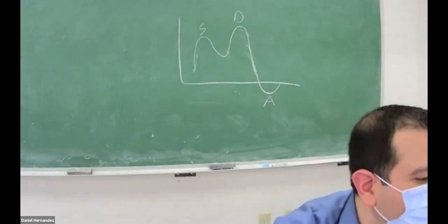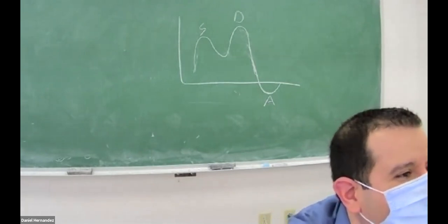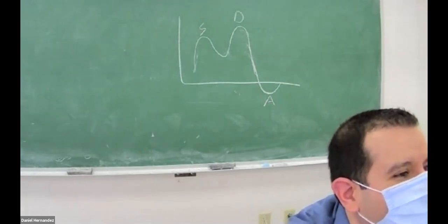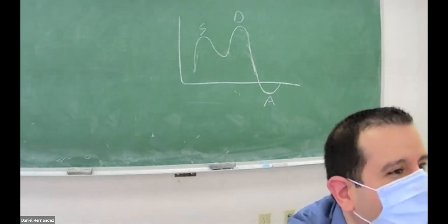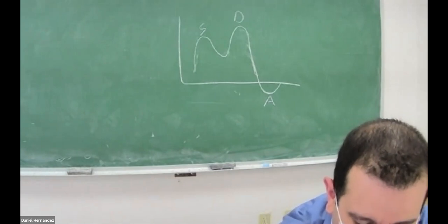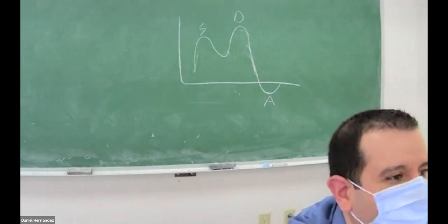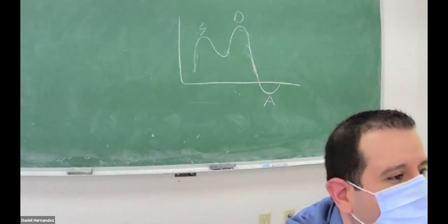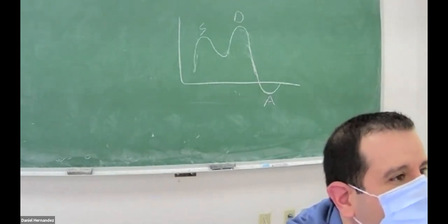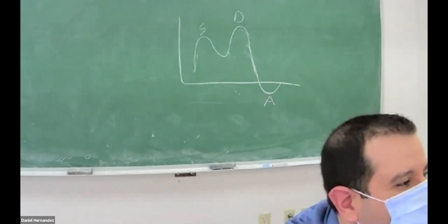So actually, go back to when Elena drew her beautiful short axis picture. We saw the right ventricle and the right coronary sinus, the right coronary cusp, seen along that right ventricle. I think she had a beautiful picture of it. So it's right, right? Yeah, that's right.